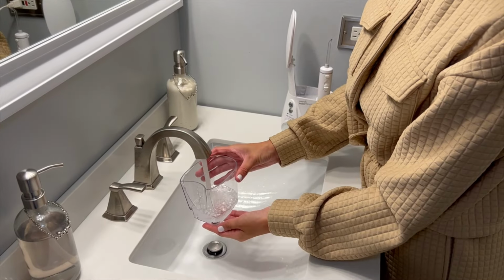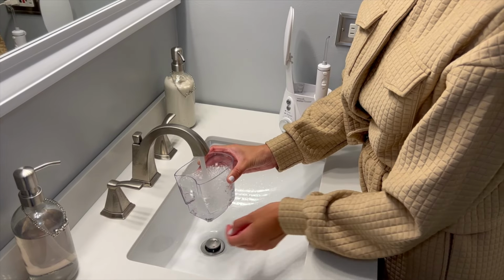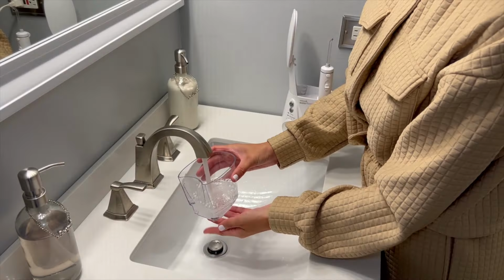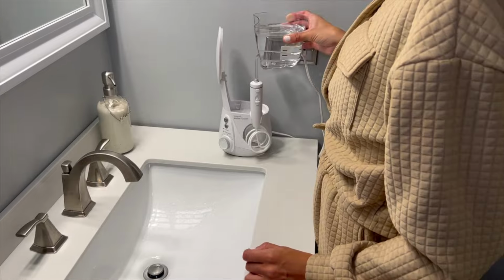So let's begin by filling up your water basin with warm water. I prefer warm water because I'm like, who wants freezing cold water on their teeth? But maybe you do. You do you. Note that some water flossers hook right into the faucet, but most of the newer models have a basin, like you see here, that you will fill up the reservoir and then place it back onto the base.